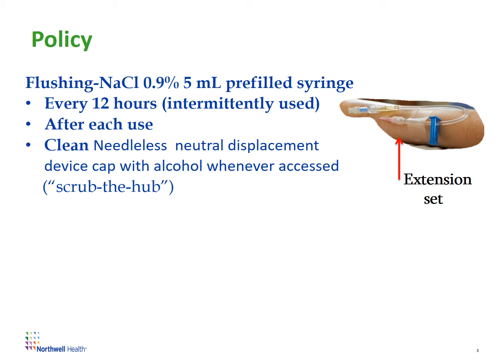Always use needleless device caps, and when you access it, those device caps should be cleaned with alcohol, which is also known as scrub the hub.